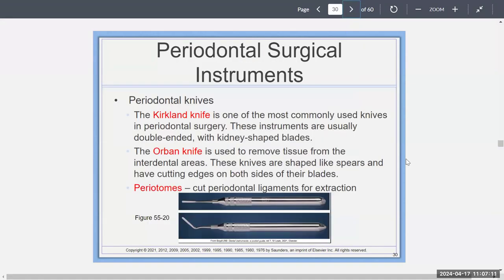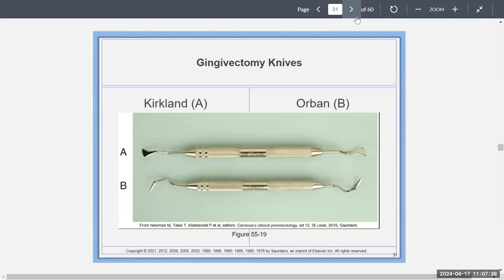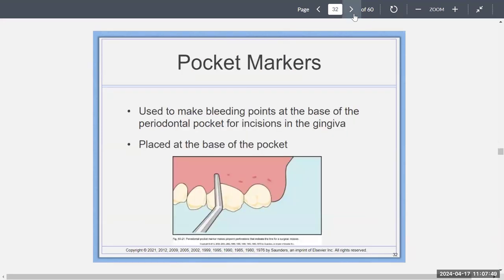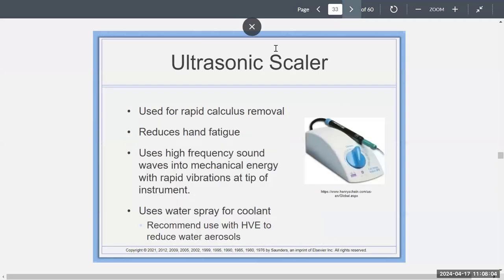Surgical instruments include knives: the Kirkland knife — one of the most commonly used, more kidney-shaped — the Orban knife, which is used to remove tissue from interdental areas and is more spear-like, and the Periotomes, used to cut periodontal ligaments for extraction. There are also pocket markers, placed at the base of the pocket to make bleeding points at the base of the periodontal pocket as a guide when placing incisions in the gingiva.